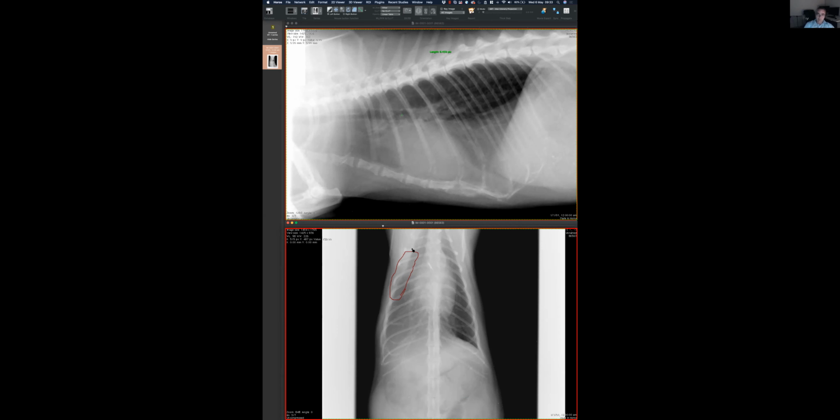So one way to think about it is that it's kind of a pyothorax and it's kind of pocketing, and that's why it's up here but not down here. The problem that I have is that there seems to be a lot of increased opacity in that hemithorax. So I expect more fluid in the pleural space, also to explain this increased opacity. And in that case, I have the expectation that I should have silhouetting of the cardiac silhouette. So this is where we are stuck. If you don't want to bring any other hypotheses, I'm happy to bring the solution, and you're going to have fun with the solution.